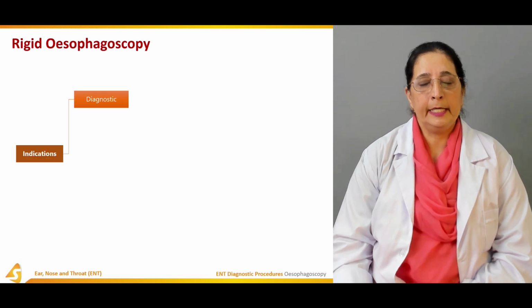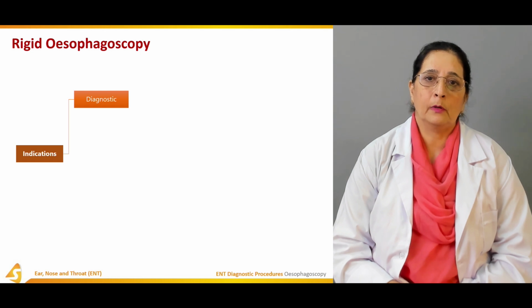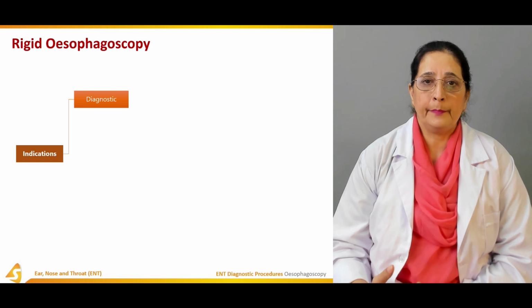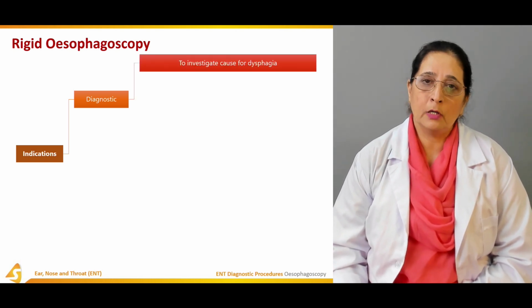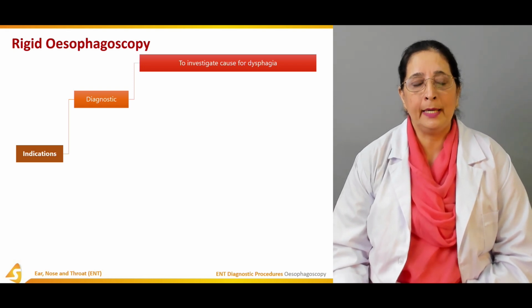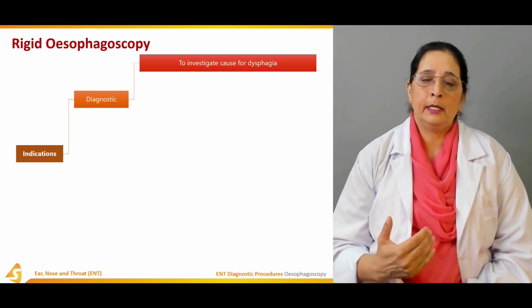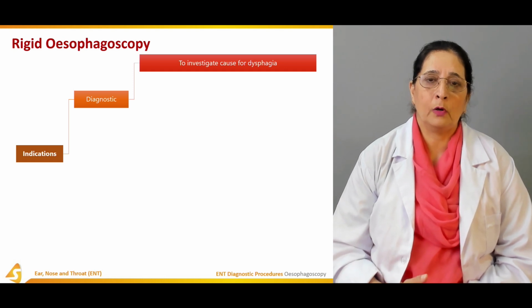The indications for rigid esophagoscopy are diagnostic and therapeutic. Diagnostic: any cause of dysphagia, difficulty in swallowing or pain during swallowing. If the patient complains, diagnosis should be done by esophagoscopy.